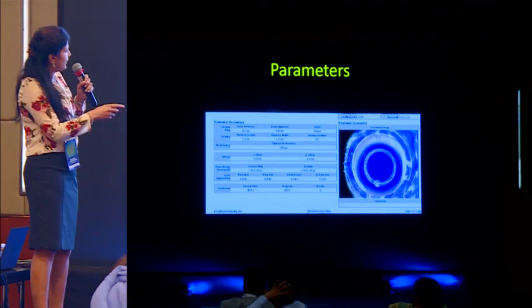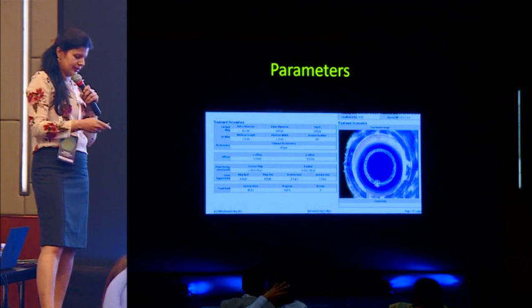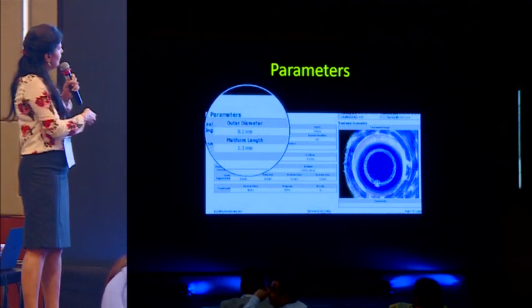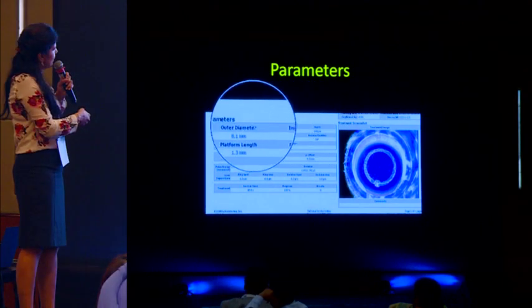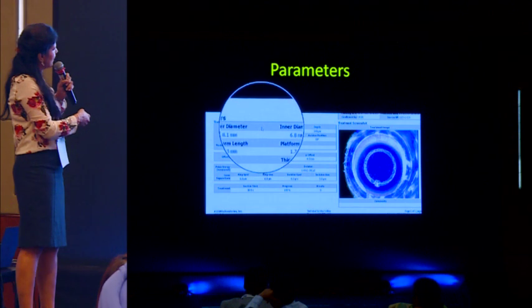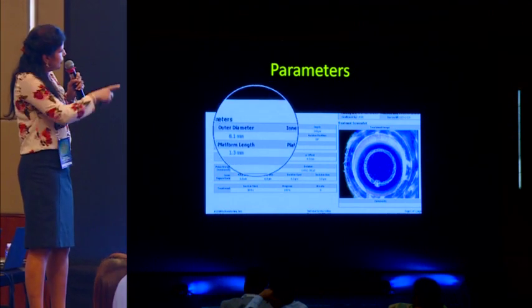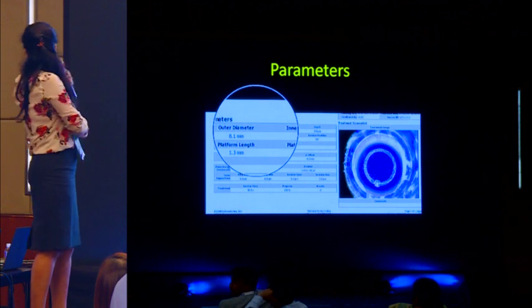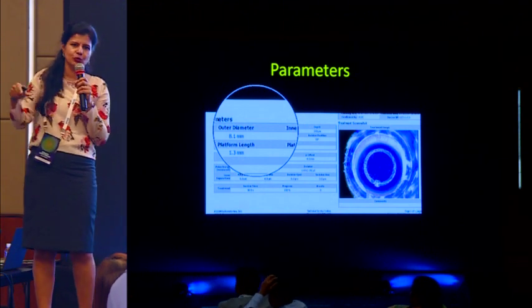Now the parameters that I basically use: you can see that the inner and outer diameters correspond to the ring that you're using. If you were using Ferrara, naturally it comes down a bit closer to the visual axis. Besides this, you use higher energy for this compared to the 0.8 microjoules that we use for LASIK.